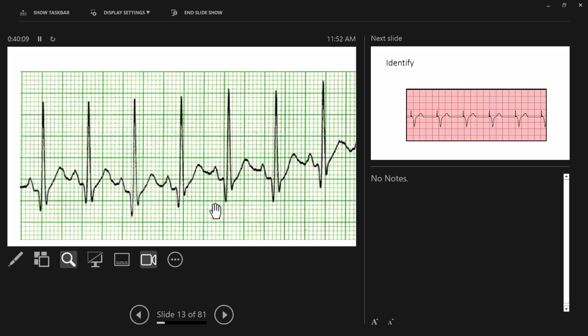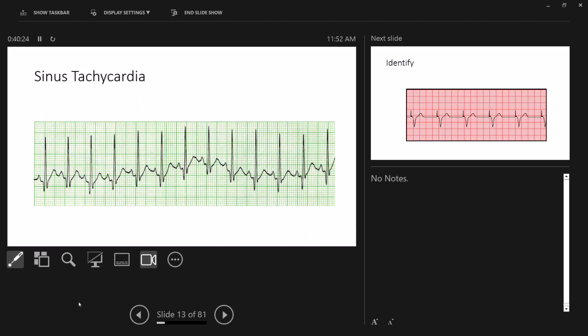When we saw SVT earlier with 190, we couldn't see the P waves. But if this converts over to SVT, now those P waves will have a tendency to disappear. It doesn't mean that they're not there, but what it does mean is that they're getting embedded in the T wave. Questions? If it's just sinus tach, then it'll still have P waves.